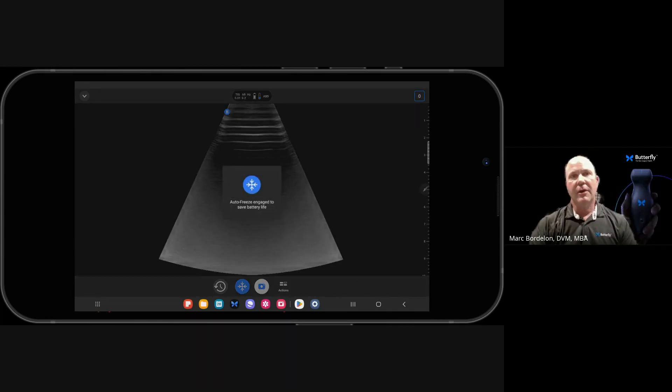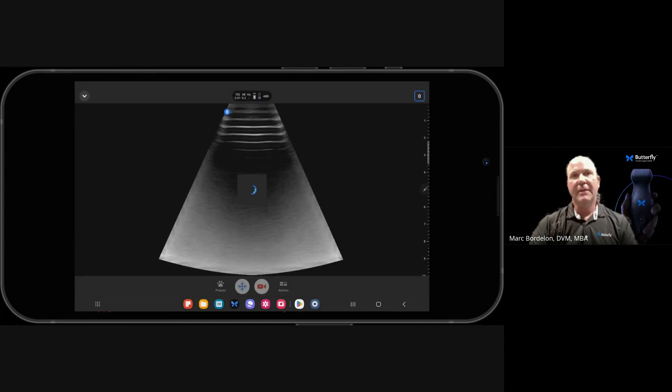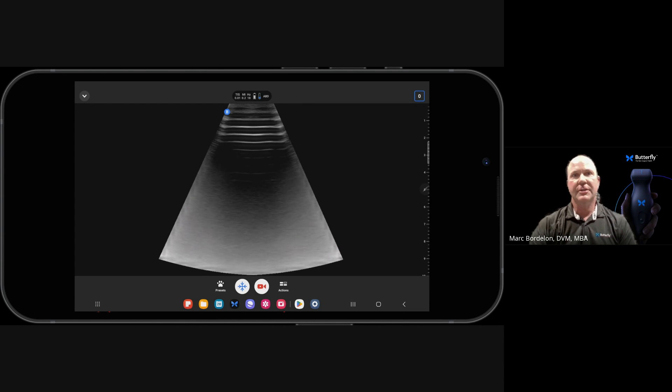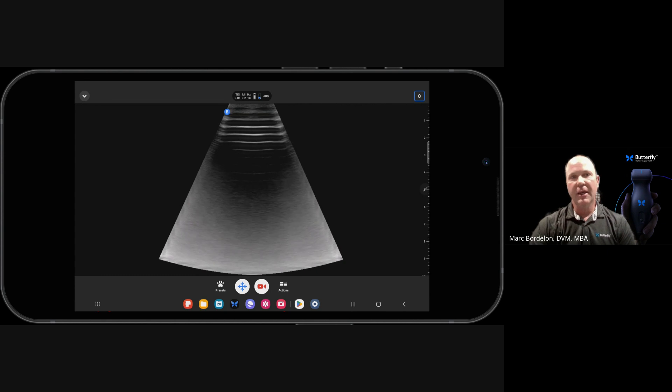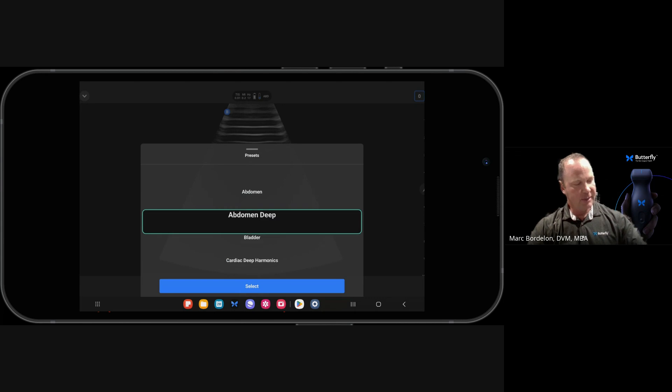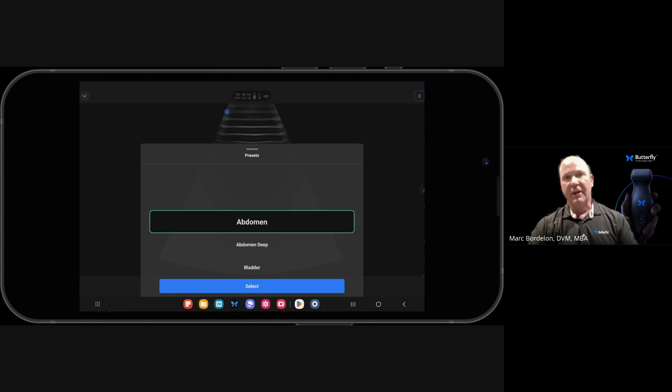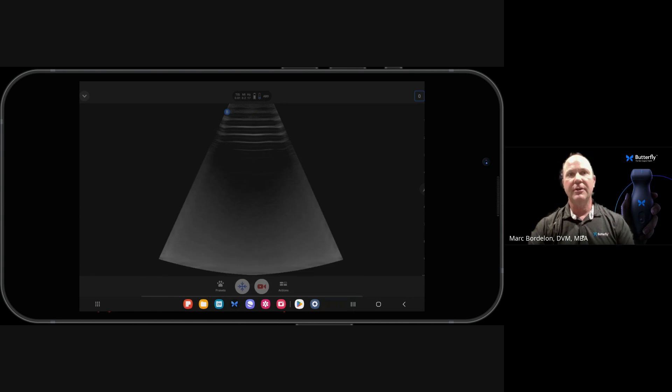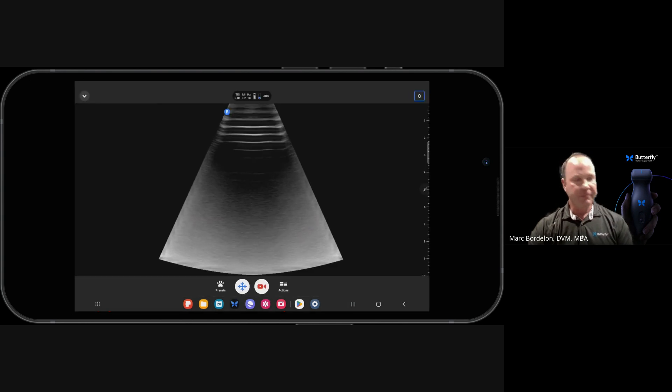In the following video, I'm going to show any Butterfly user simple steps to optimize their picture, regardless of what they're scanning and what preset they're in. The first thing we must understand is the presets. A thorough breakdown of those presets can be found in your manual.